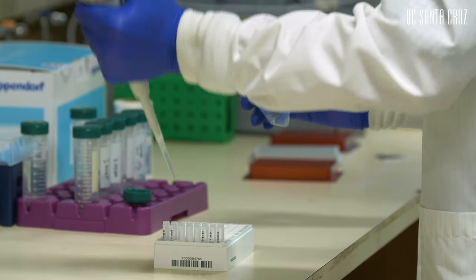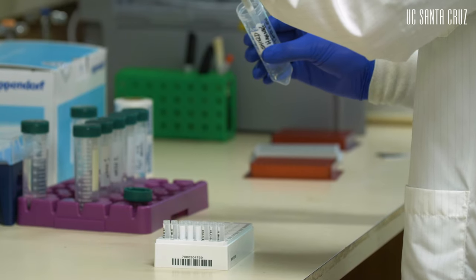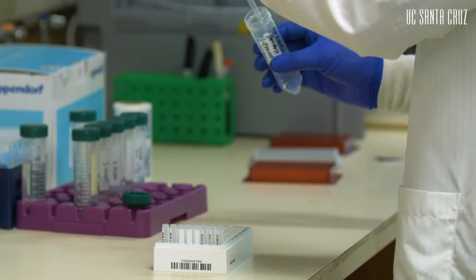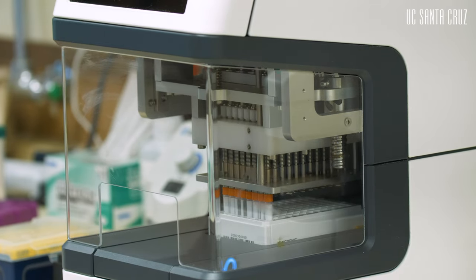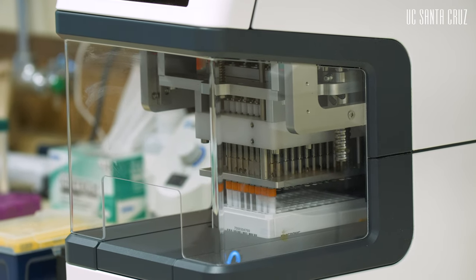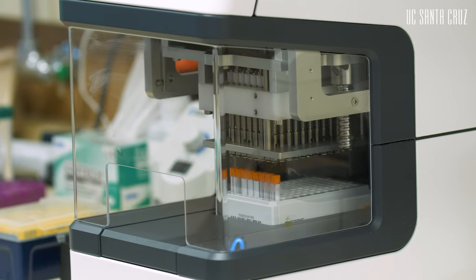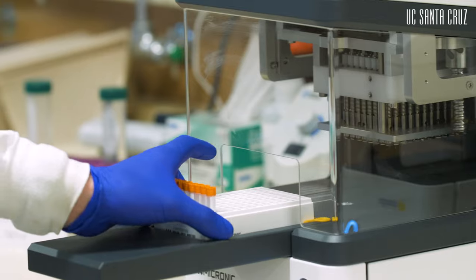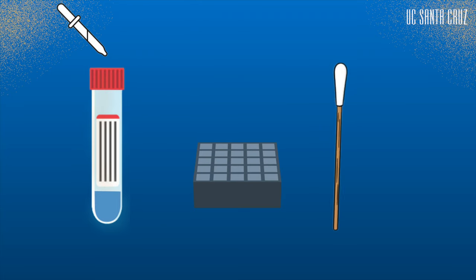RNA shield is dispensed into 1.4-milliliter 2D pre-barcoded tubes. Etched barcodes allow us to process samples in a high-throughput manner to instantly know which samples are coming back to us. The test kits are built in-house in our lab. The kits can be assembled in minutes using our Agilent Bravo, which is a 96-well liquid handling robot that can very accurately dispense liquid. The kits include tubes filled with RNA shield, racks, and swabs.